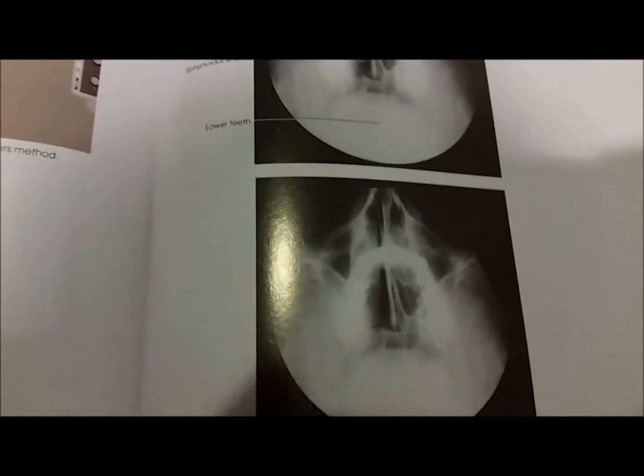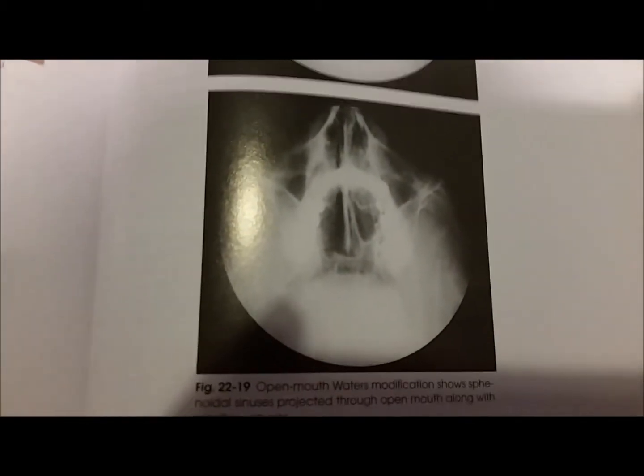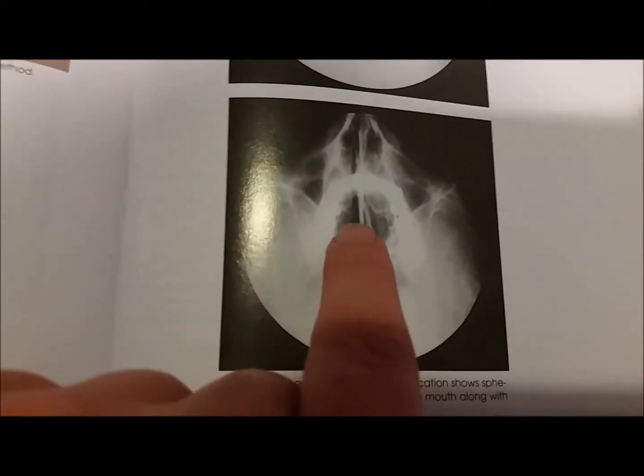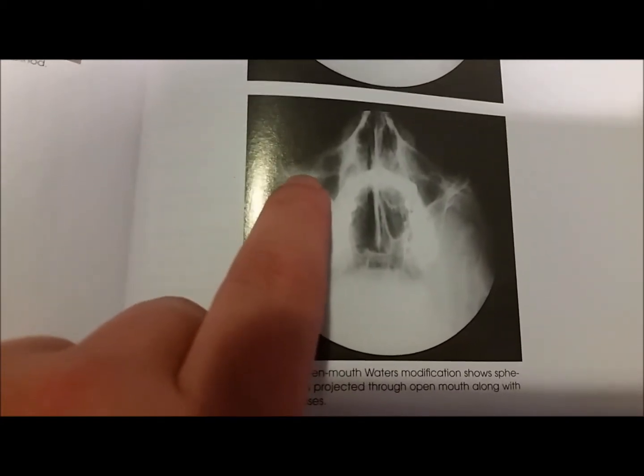Finally, we have the open mouth Pirie view of the Waters method, which looks similar, but with the mouth open, you now get a very clear view of the sphenoidal sinuses right there, with a nearly tangential view of the maxillary up above as well.